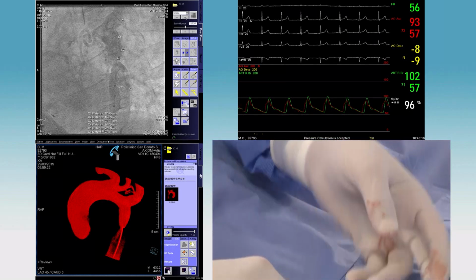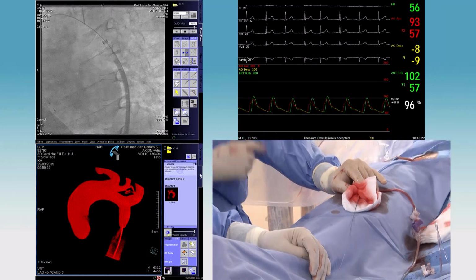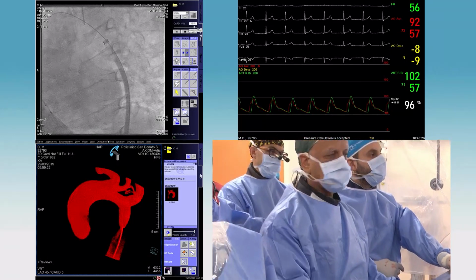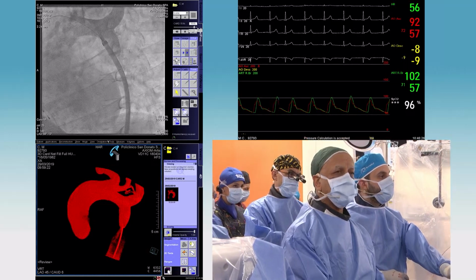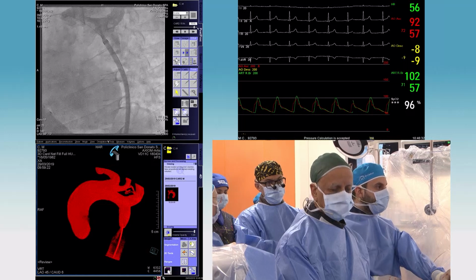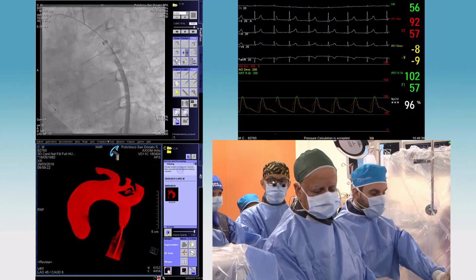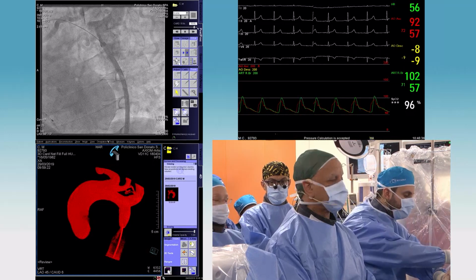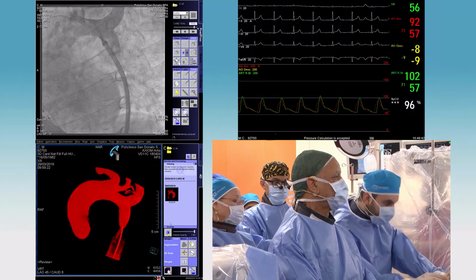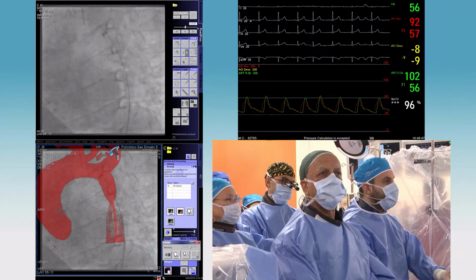So the next angio we will show you is after Luca has put a 14 French Mullins sheath in place. This stent requires a 14 French. The smaller diameters, around 16 or less, require a 12 French sheath, I think. This one, 18, 20, 22, all of those require a 14 French sheath. So the sheath is in, the Mullins sheath. Can you see that in position? Yes, we can.